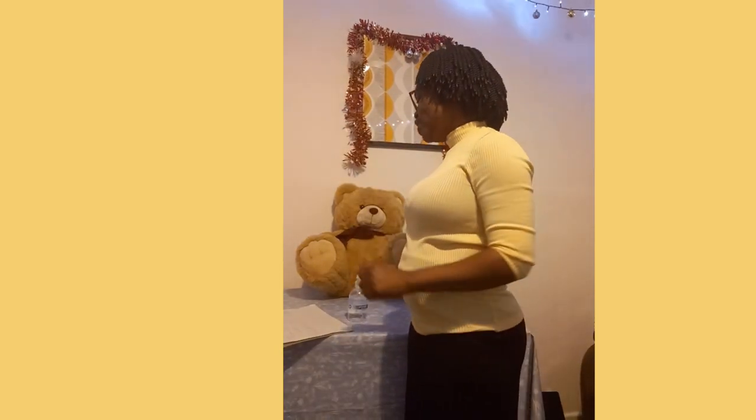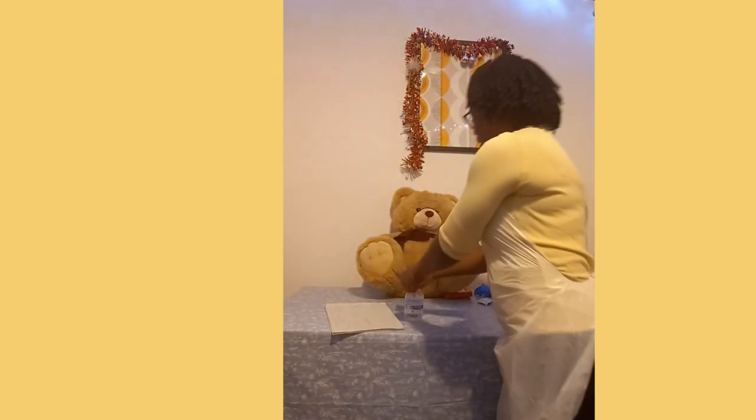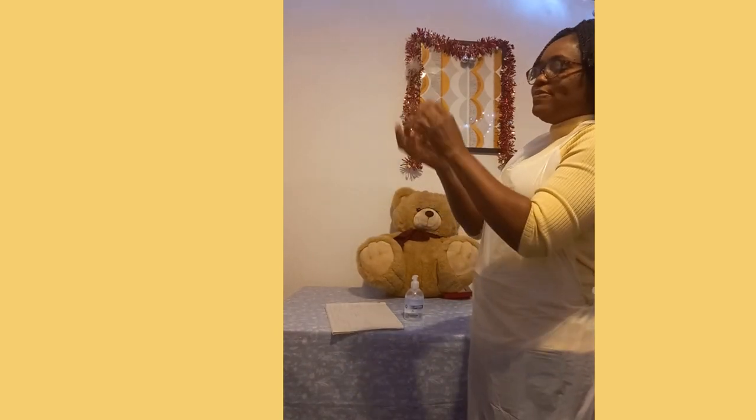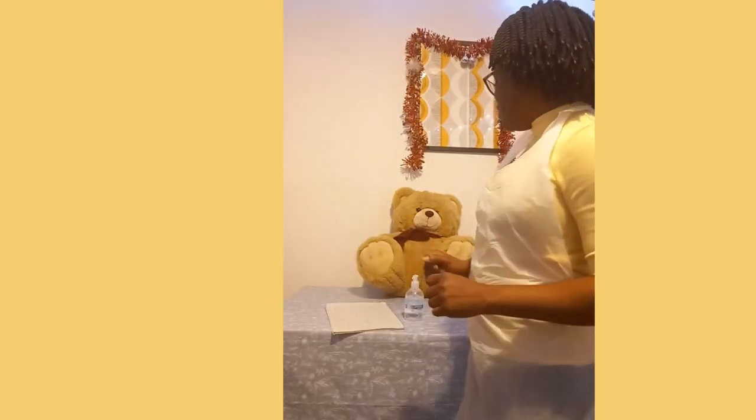Malcolm, I will be leaving you for now to quickly go and gather the materials. If you have any concern, please give me a shout and I will be here as soon as I can. When you leave your patient's side to gather materials, go for your apron first — if you have it at the back of your mind that you must wear your apron first, it will save you from forgetting. When performing subsequent hand hygiene steps, you don't need to verbalize each one, but you must not miss any of the steps.